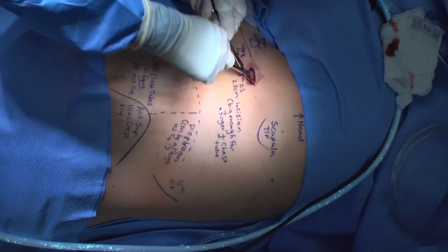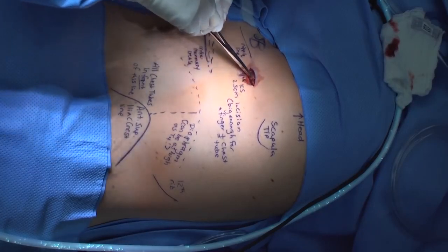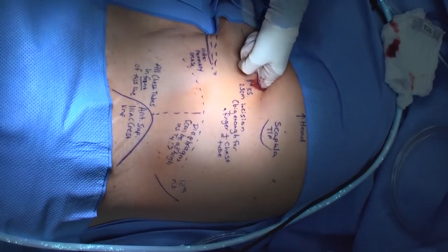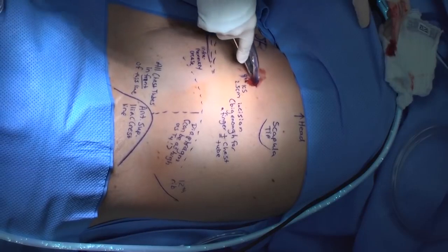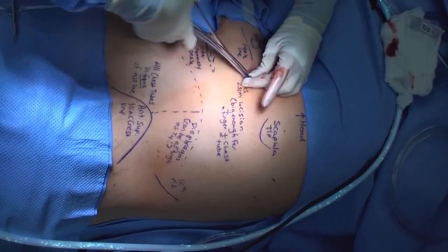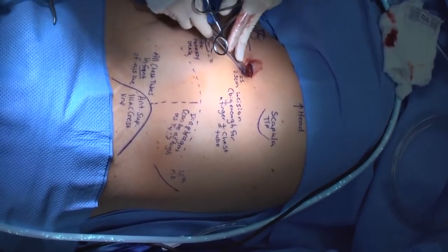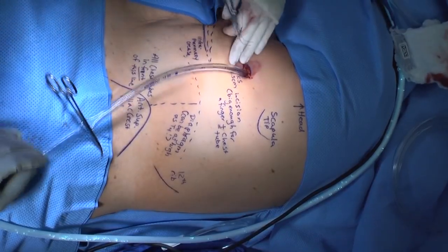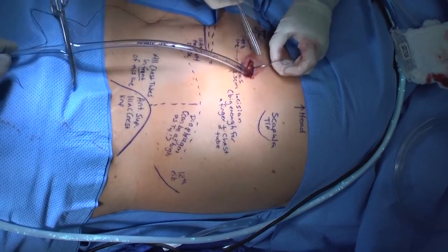Dilate the tract, starting at the level of the pleura, backing into the muscle, the sub-Q, all the way up to the level of the skin. Perform a finger sweep to confirm that there are no adhesions. Insert the chest tube using a Kelly clamp or your finger to guide the tube into the desired location. Apical for air, posteriorly for fluid, or into the specifically desired collection. In an awake patient, the finger can be very helpful in directing the chest tube away from the fissure and keeping it along the chest wall.